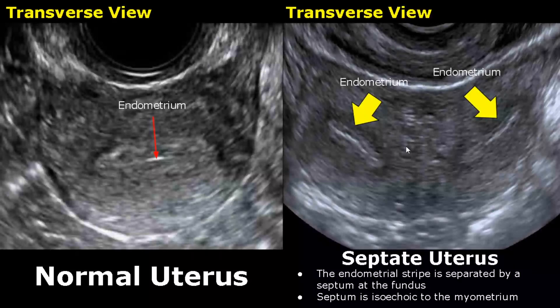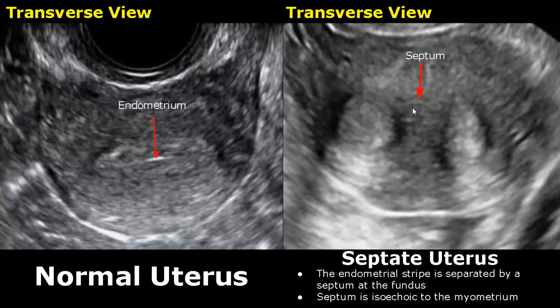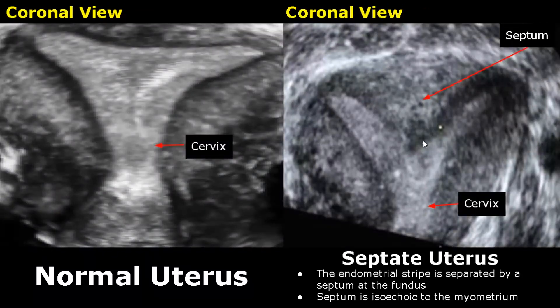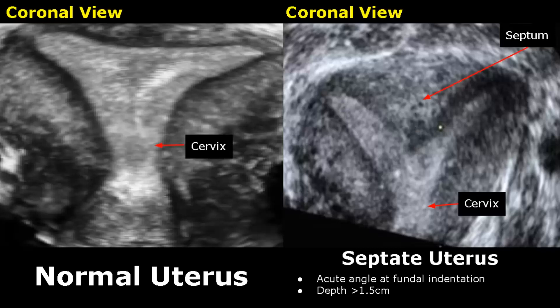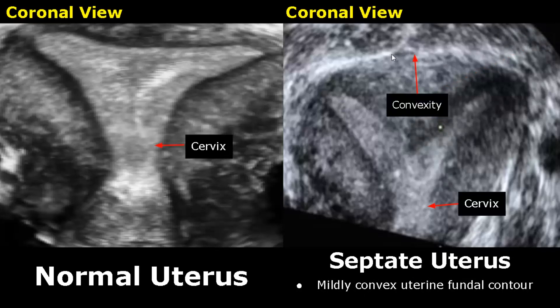In a septate uterus, the endometrial stripe is separated by a septum at the fundus. This is the septum in transverse view — you can see that it has divided the endometrial stripe. This septum is isoechoic to the myometrium. Here is another transverse image of a septate uterus; an isoechoic septum is seen separating the endometrium. In coronal view, we can see a thick isoechoic septum in the middle of the uterine cavity. There will be an acute angle formed at the fundal endometrium, and the depth of this indentation will be greater than 1.5 centimeters. The uterine fundal contour is convex-shaped here, but it can be flat as well.